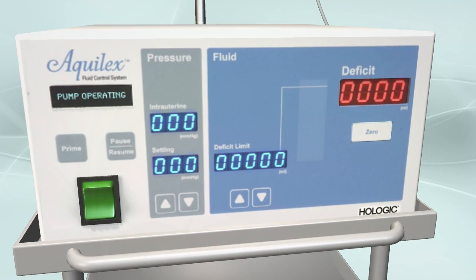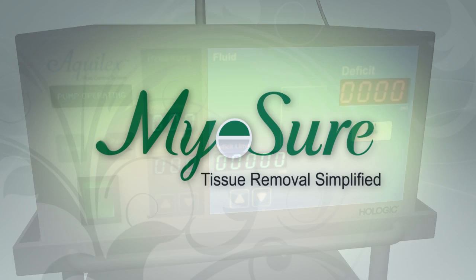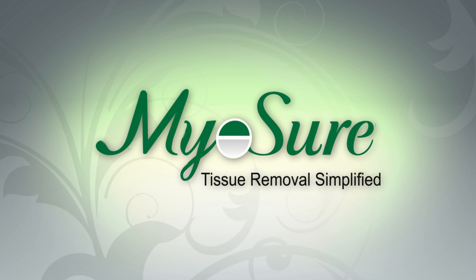Always monitor fluid deficit throughout the procedure in accordance with the ACOG guidelines. Thank you for your attention.